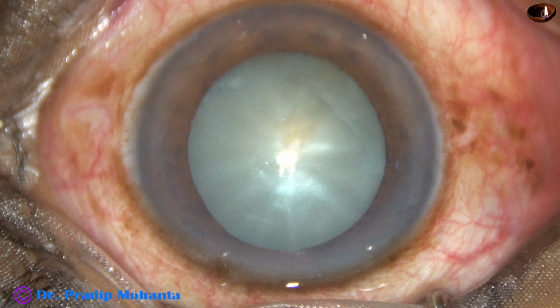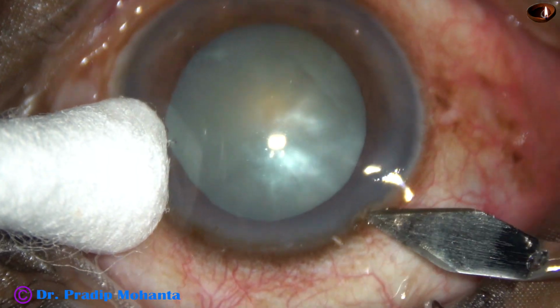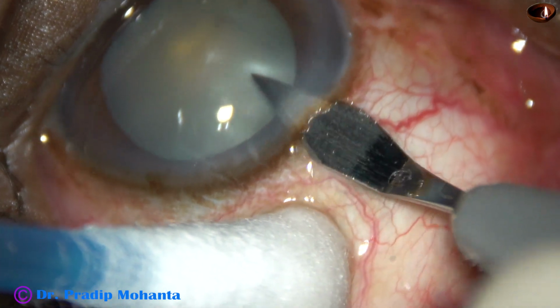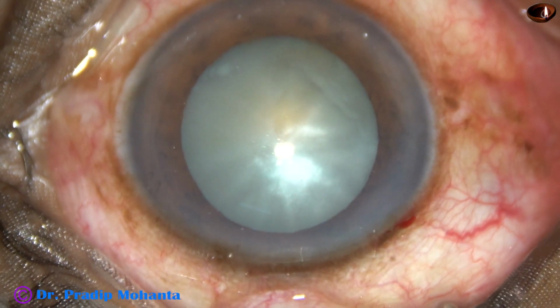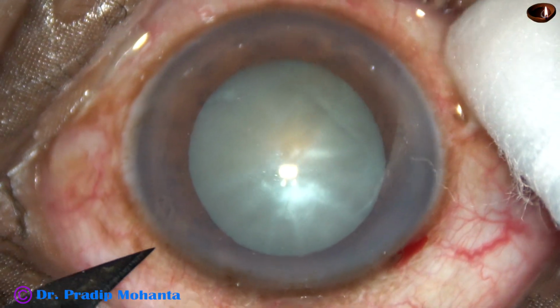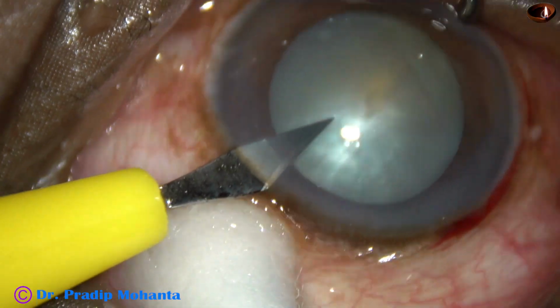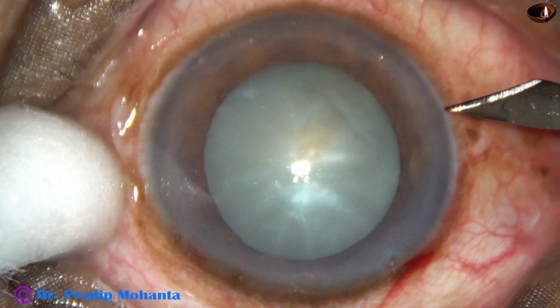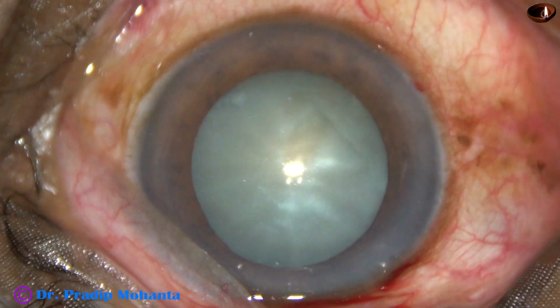This cataract appears like an intumescent cataract, but it is not. Let us observe this surgery. This is the main incision at around 10:30 o'clock. About 3 o'clock hours away, this is a side port on the left side of the main incision, and about the same distance away, this is another side port on the right side of the main incision.